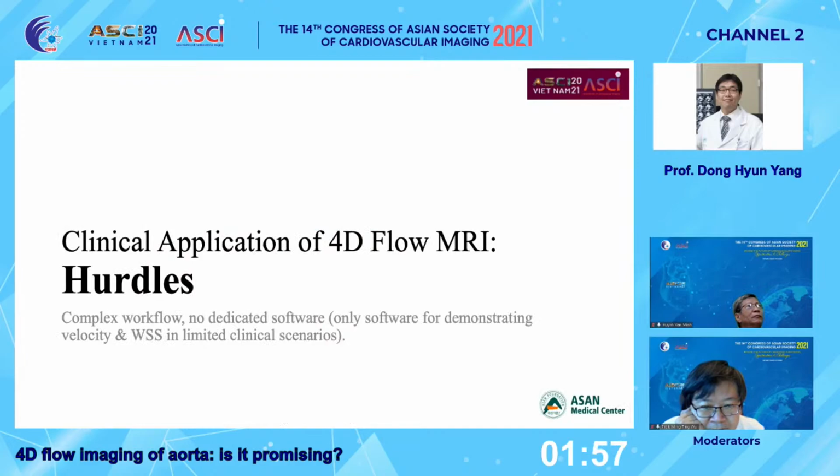Still, we have a lot of hurdles for the clinical application of 4D flow MRI. A dedicated software module that fits a specific clinical scenario, such as pressure gradient estimation, could be a solution, and I hope my group could contribute to setting up this solution.